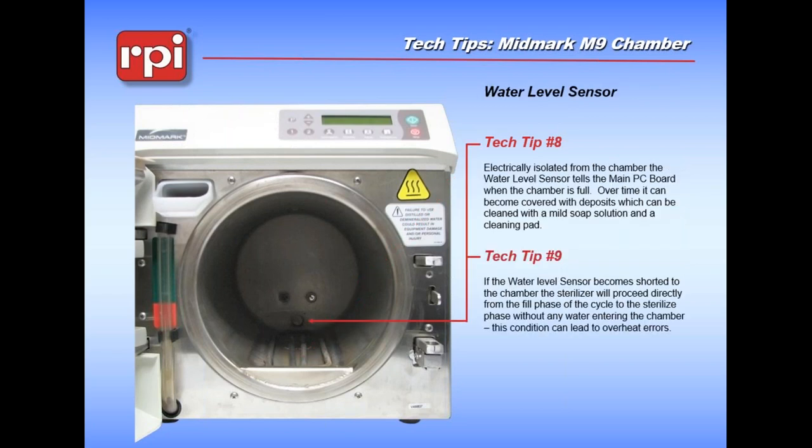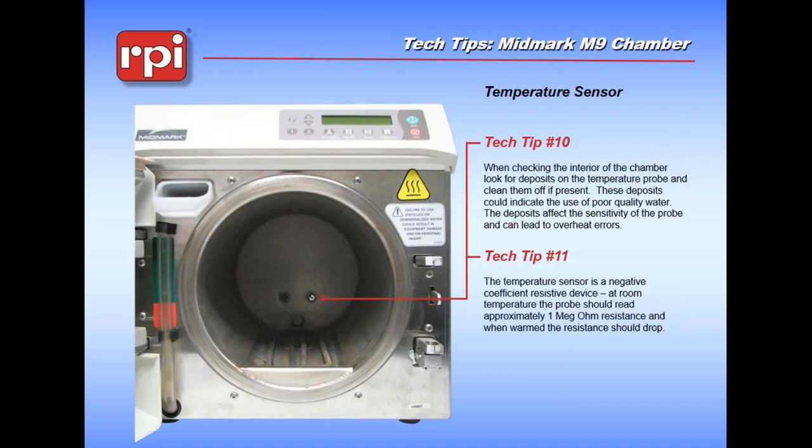The water level sensor is electrically isolated and used to measure whether there's water in the chamber. It can become shorted to the chamber - there are a couple of little insulators in the back of it that can be replaced. It can also become gunked up, requiring you to clean it. Regarding the temperature sensor: there is a possibility that deposits could build up on it. In this newer style machine it's an RTD, so if you ever want to know if that temperature sensor is actually functional, you can easily measure its resistance and watch the chamber temperature.